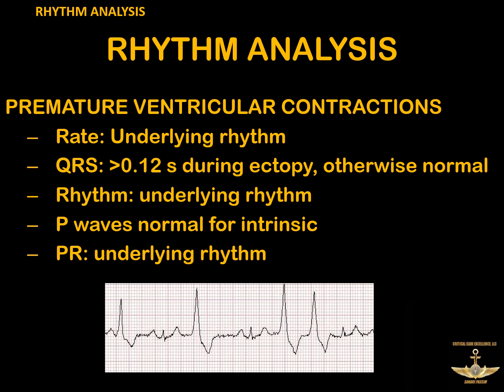So the first thing we'll start with is the ectopy. So premature ventricular contractions, or PVCs. You may hear people talk about these a lot. There's been a pretty big shift over the last 20 years or so about what we do with PVCs. And what we do with PVCs now is not a whole lot. We used to treat these pretty aggressively with drugs and some other interventions, and we found that to be largely unnecessary.